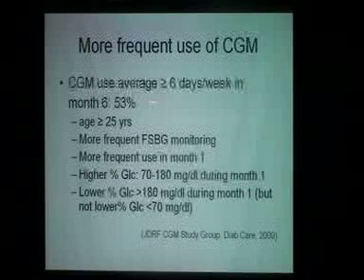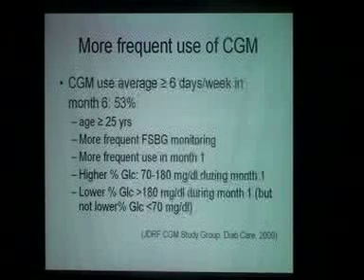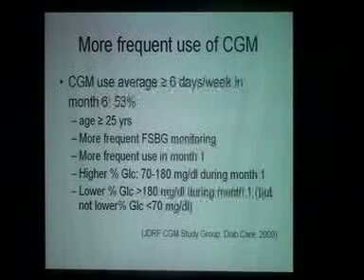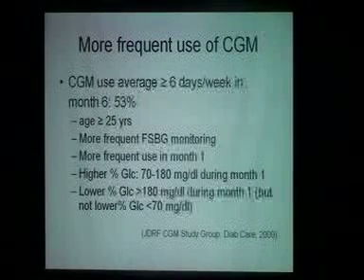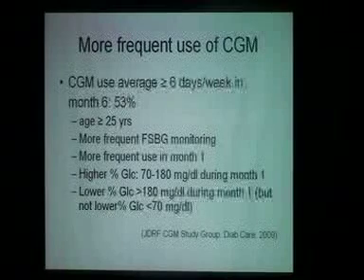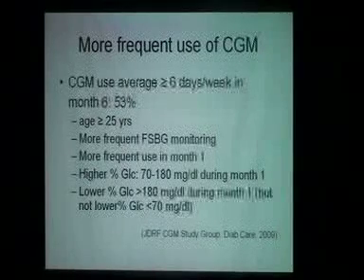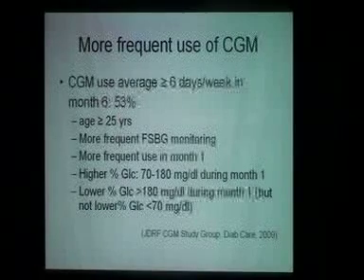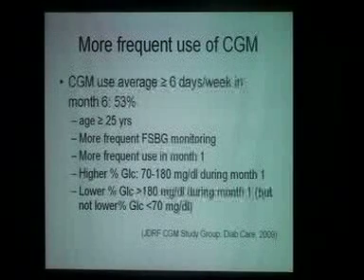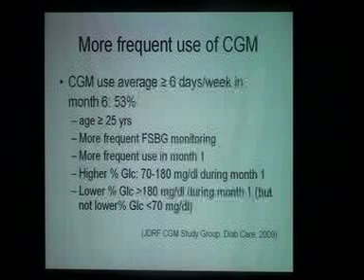And the patients that, in their first month of CGM use, had used it more frequently, stayed with the CGM use better after 6 months. So in the first month, either they got better results because they were wearing it more often, and this encouraged them and they stayed with the CGM better, or maybe they were patients that were more aggressive, and they were paying more attention to their diabetes. But these 2 were the only 2, and the other factor was how often they were checking their blood sugar at baseline. So the ones that were checking more than 6 times a day, they stayed with CGM longer at the end of the 6 months.